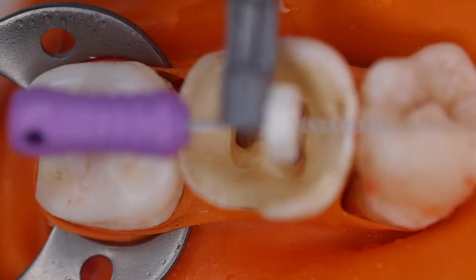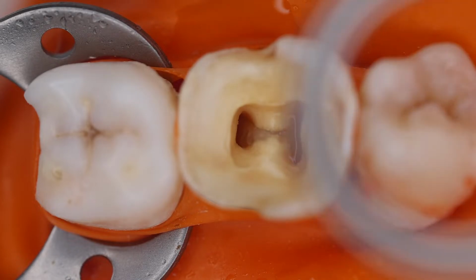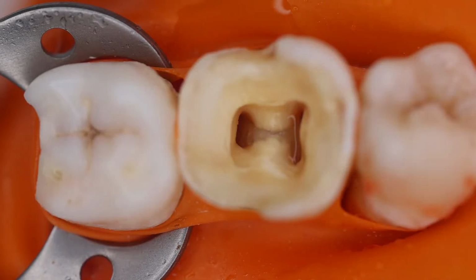This is the file clip of the electronic apex locator, and the second is the lip clip. This is the lip clip. Over here we are using the Root ZX mini apex locator from J. Morita.